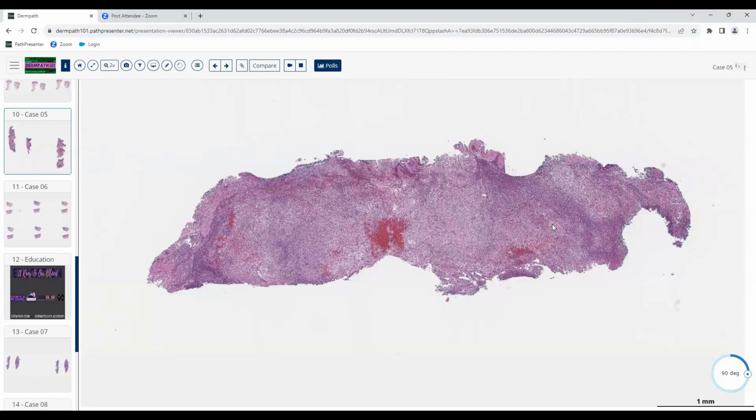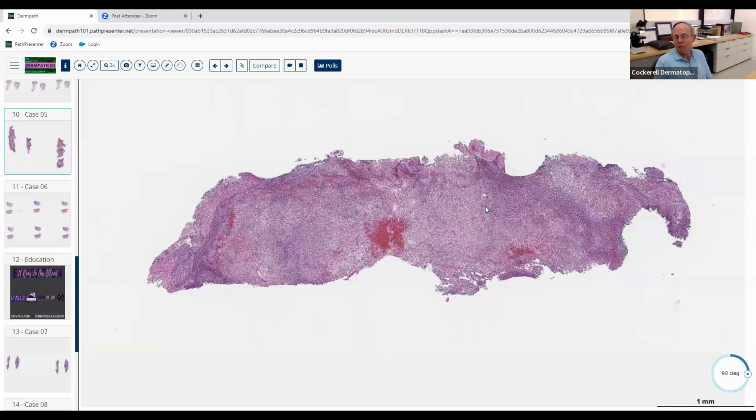Maybe Sweet syndrome? Sweet's can do it. Pyoderma gangrenosum can do it. Can't stop there. What else can do it? Infections. Good. Which kind of infections, by the way? Usually acute, most commonly bacterial. Yes, pyogenic infections, exactly. Staph, strep, those kind of things. Yeah, abscesses. We get biopsies of abscesses all the time, and they just show tons of polys, like this.